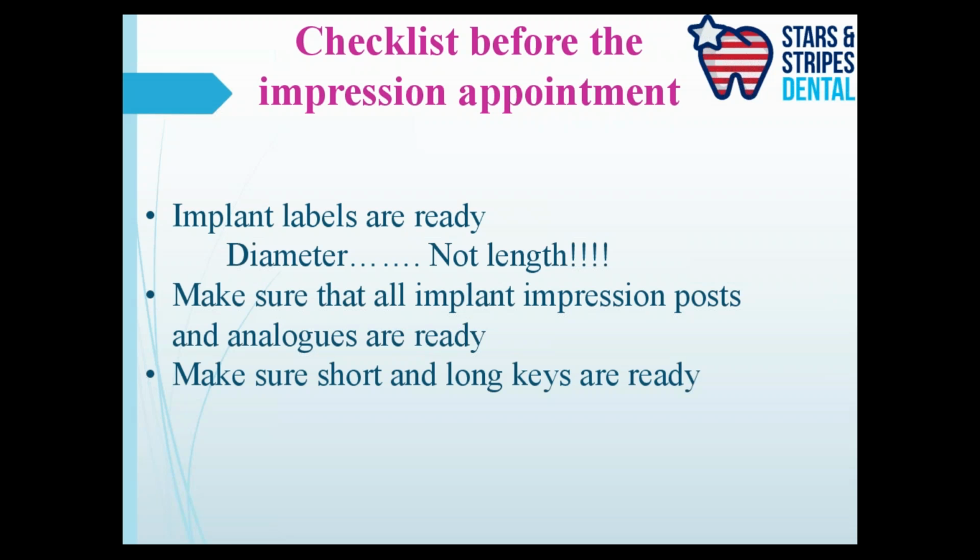Remind me, I'll share a template sheet that I maintain in my clinic for all the implants that I have placed. Because when you place the implant, you let the patient go for about 3 to 4 months, then the patient comes back. The time has passed. If you have not kept a record of which implant was placed in that particular patient's mouth, you'll be scrambling. You will never be able to guess the diameter from the x-ray correctly, and you don't want to do that guesswork. So record keeping is really, really important in terms of implants. Make sure you have all the tools and all the components ready. Make a checklist and train your staff properly, so they are also prepared.